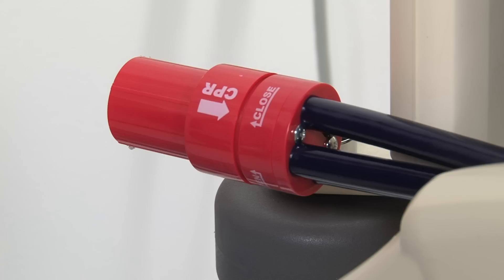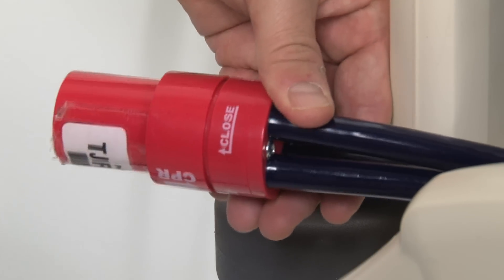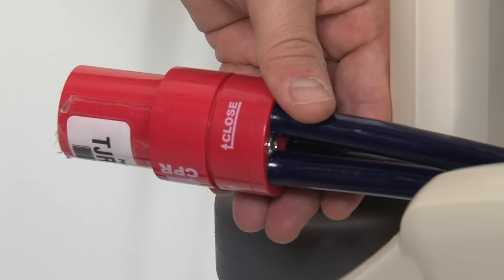Located at the head end of the mattress is the CPR release. Simply grasp and turn the valve counter-clockwise and the mattress will rapidly deflate. On the Dolphin VMAT system, the CPR release is located at the foot end.